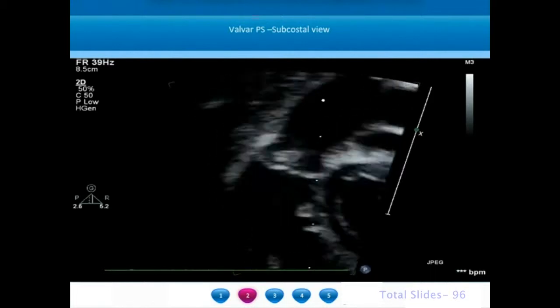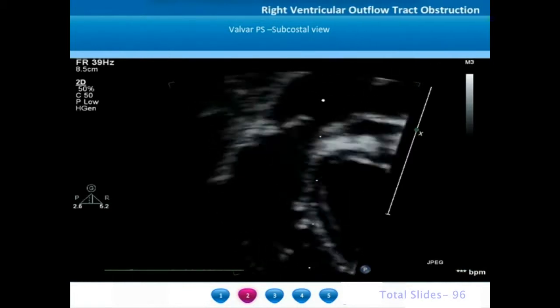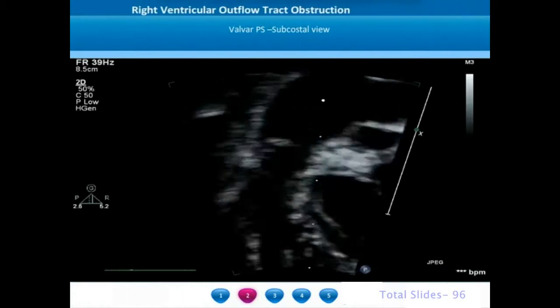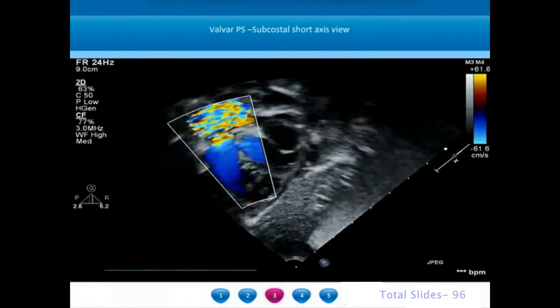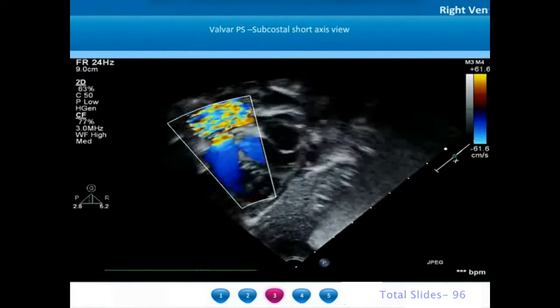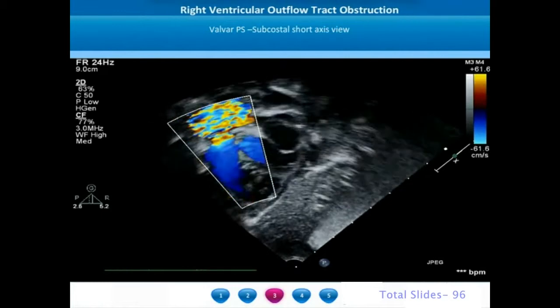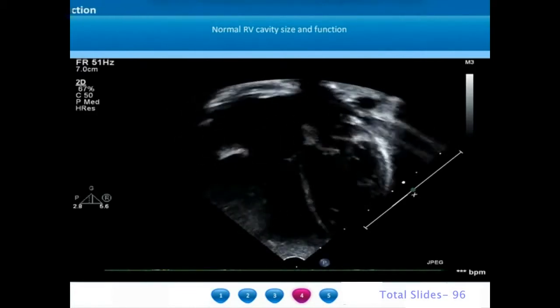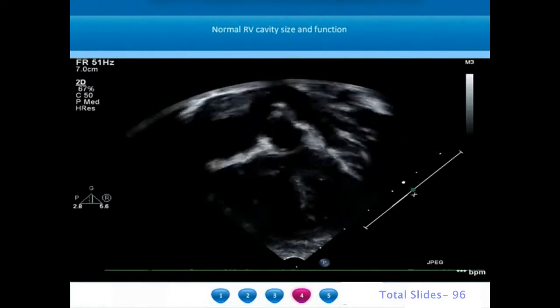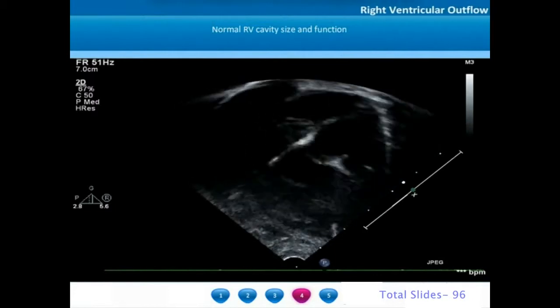A subcostal short axis view of a patient with valvar pulmonary stenosis shows the doming pulmonary valve, the normal wide open right ventricular outflow tract below the pulmonary valve, and a post-stenotic dilatation of the main pulmonary artery. On color Doppler interrogation we can appreciate turbulence of blood flow beyond the pulmonary valve and confirm there is no pulmonary regurgitation. In early stages, right ventricular systolic function is well preserved so the right atrium and right ventricle are not dilated.